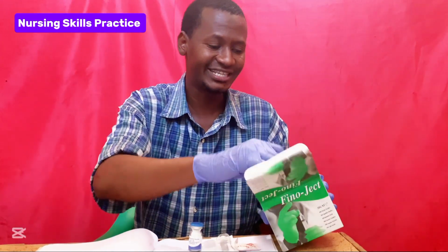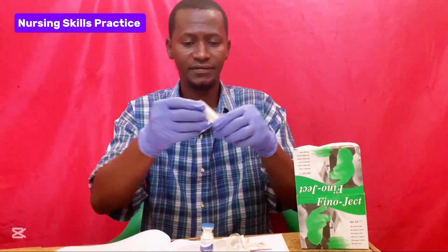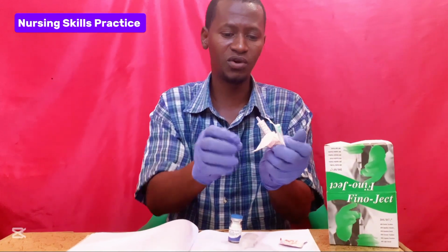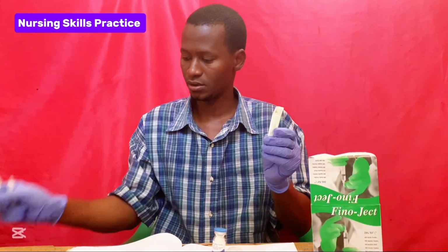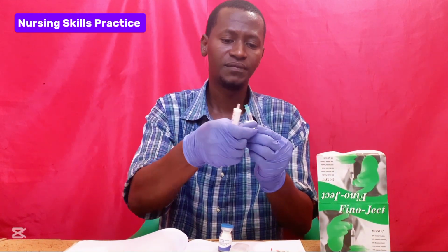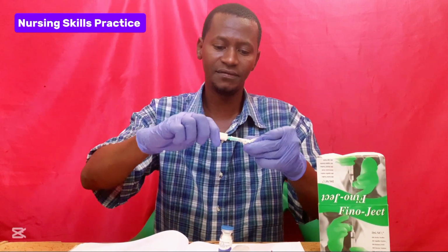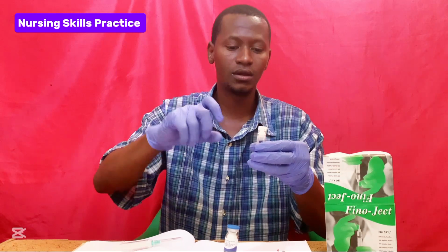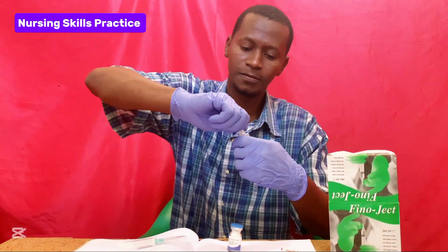What about the 1 gram powder for injection? In the 1 gram powder for injection, you can dilute or reconstitute with 5 millilitres of sterile water for injection. This is how you are going to perform. Make sure you get the syringe together with a 21 gauge needle. Remove the syringe from the manufacturer's packaging. Then get the needle and remove it from the manufacturer's packaging. Then open the plastic vial to withdraw the sterile water for injection.